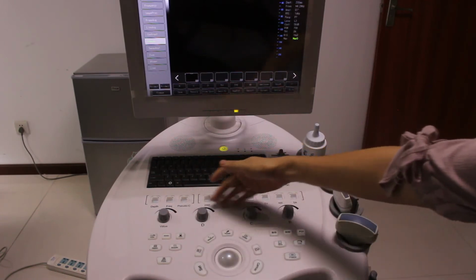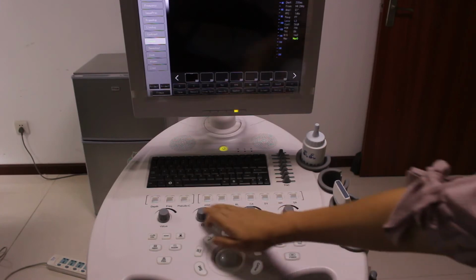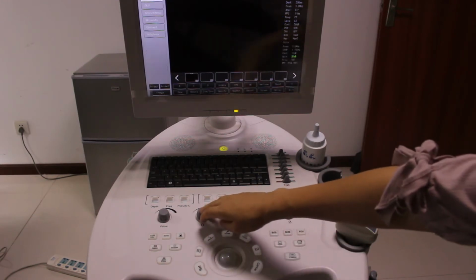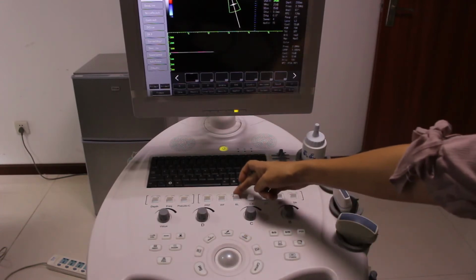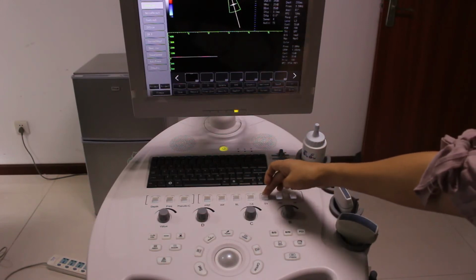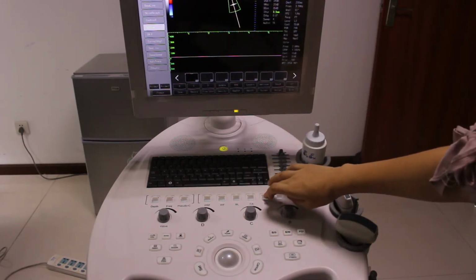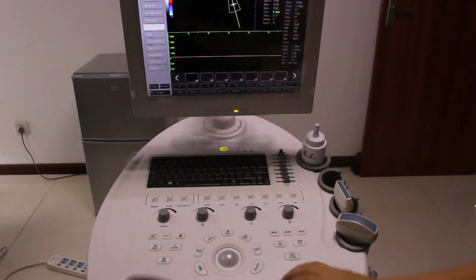And these buttons here are always used with the PW mode. B, C, D, and update. We only use the baseline to change the baseline to get a better PW. Also, the sample volume here is used to get the best blood flow to have the perfect PW mode.